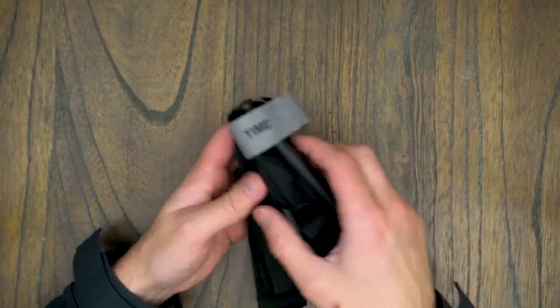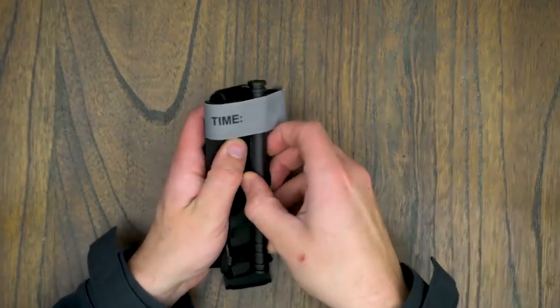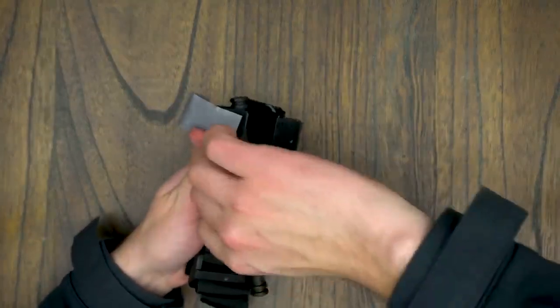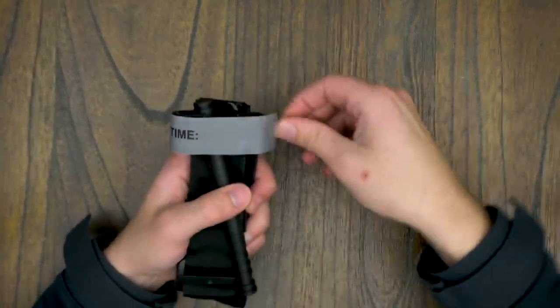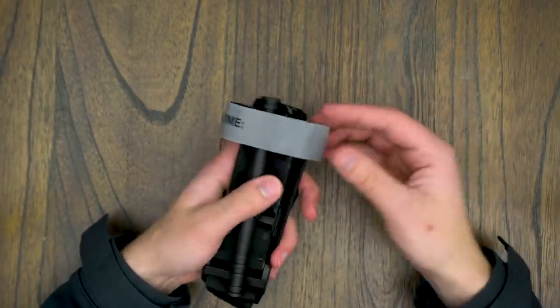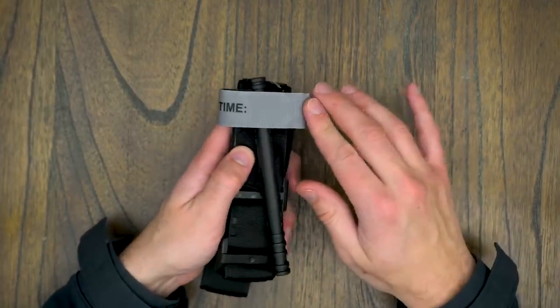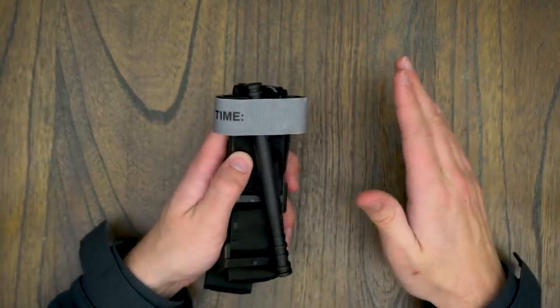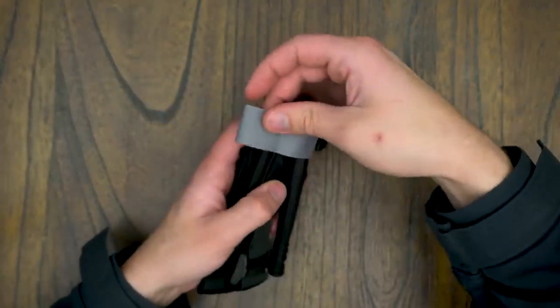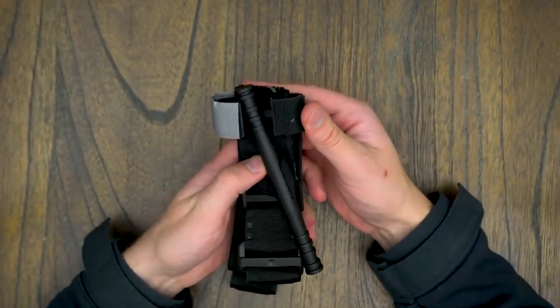So you've taken the tourniquet, you've applied it on the arm, you've tightened it up as much as you can, and now you're trying to move the windlass, and you have to peel that back, push it over, tighten the windlass, and then redeploy it. That's a pretty big time sink, and it could be the difference between life or death, and there's really no reason to store your tourniquet like this. I know people think it looks a lot cleaner on their belts, but really that doesn't matter. Just pull this time tab over, fold it back on the tourniquet, and that'll just stay out of the way.